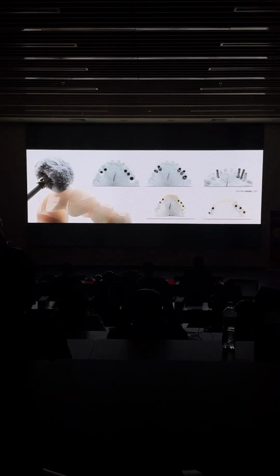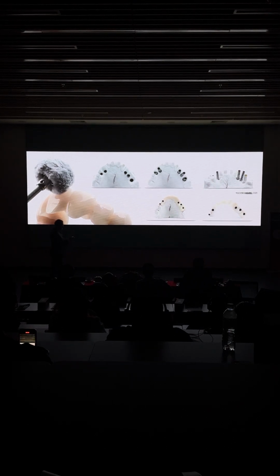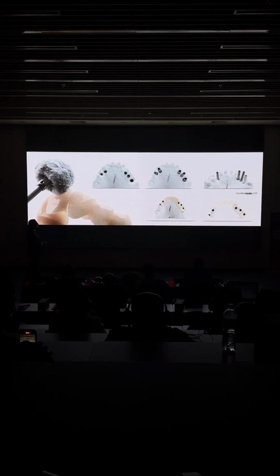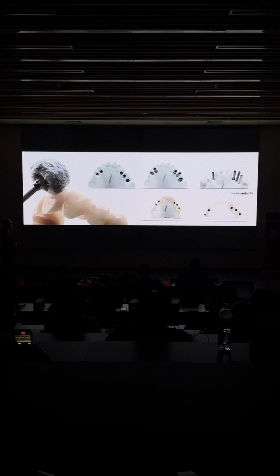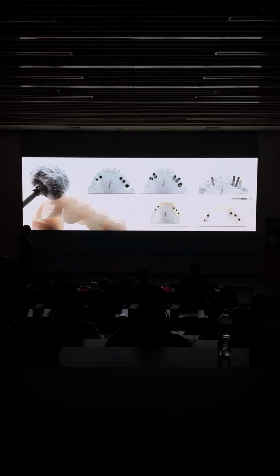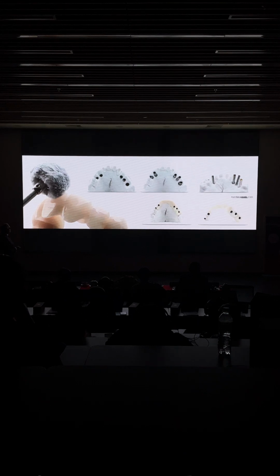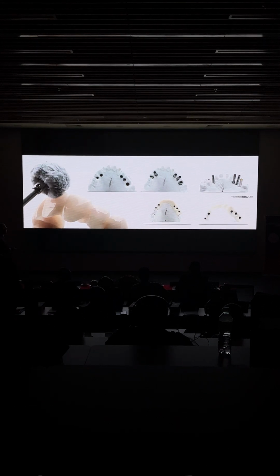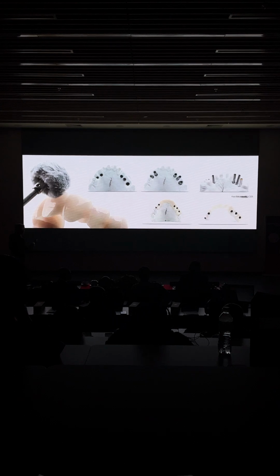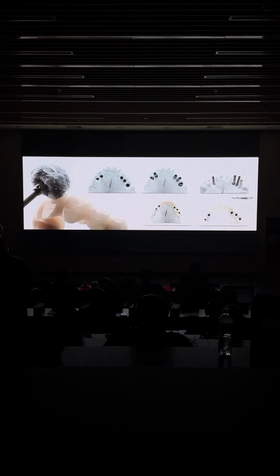So now I need to do a provisional restoration. I have to create an emergence profile from those implants that are too supracrestal. They are not deep enough. So that's why my effort was to create as much tissue vertically to the implant head. And then I went to the office and showed my technician, Yoshi, how much pressure I want on each implant in order to push the tissue.